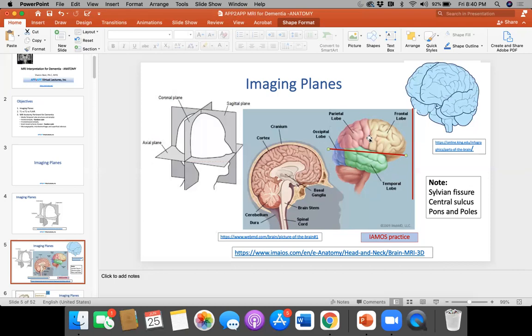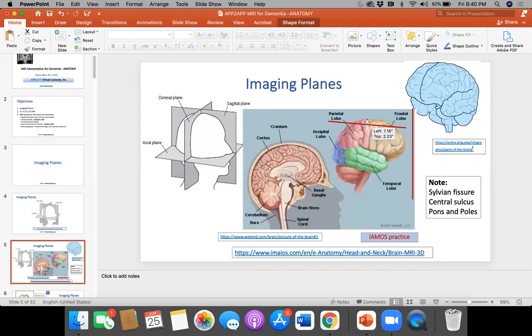We'll start to see that very inferior portion of the frontal lobe come into view — this important portion with dementia is called the orbital frontal gyrus. As we continue scrolling superiorly and get above the occipital lobe, we can eyeball that slice and see that half is frontal and half is parietal. We continue frontal parietal, frontal parietal, and you're finished. You want to anticipate what you should be seeing first on the sequence you're looking at, and then anticipate what you should be seeing in the next few slices.